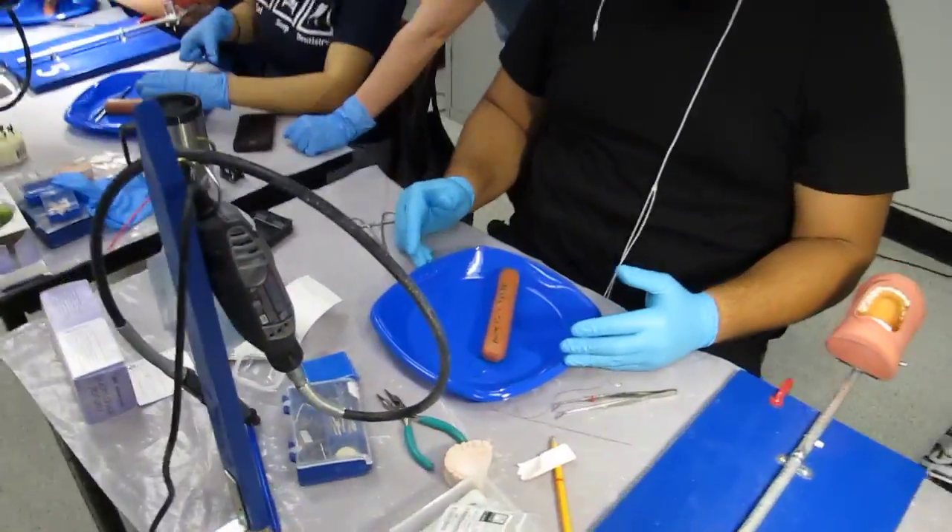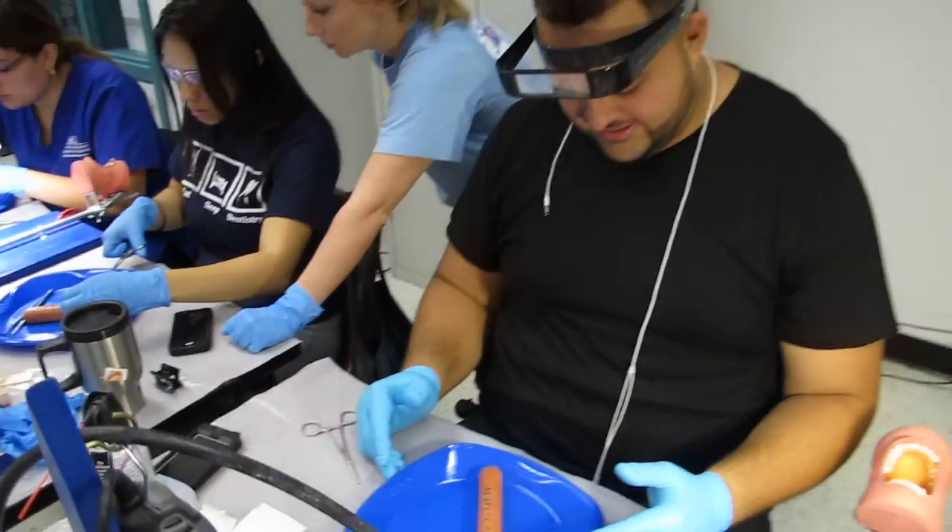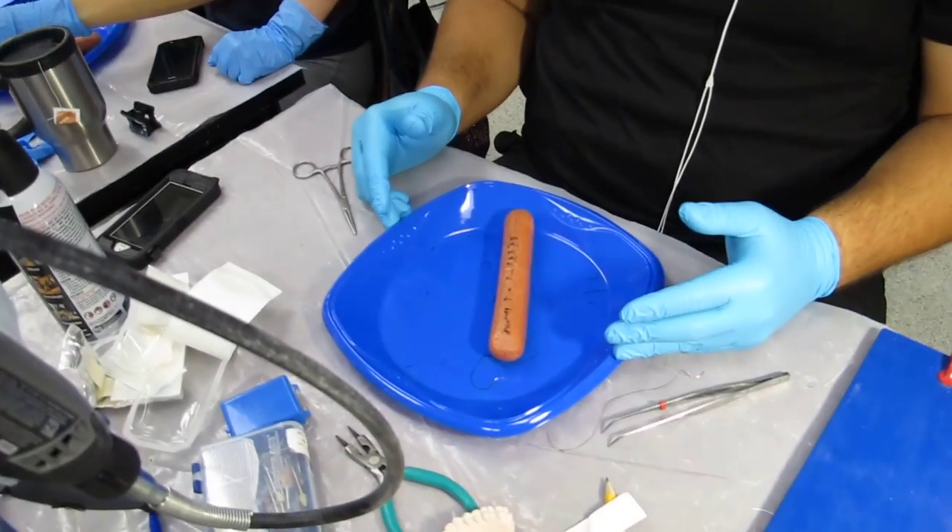Let's see, Dr. Peter, how's your patient doing? Looks good. You got the suture idea right down. Very nice.